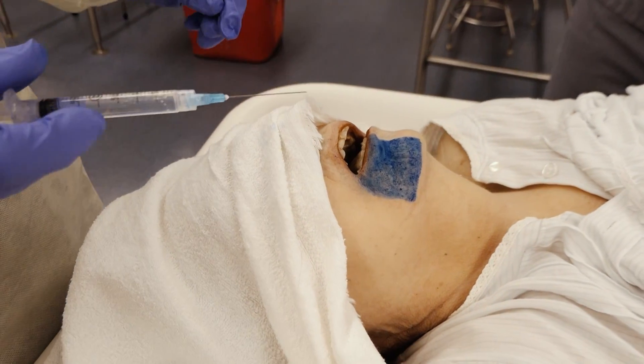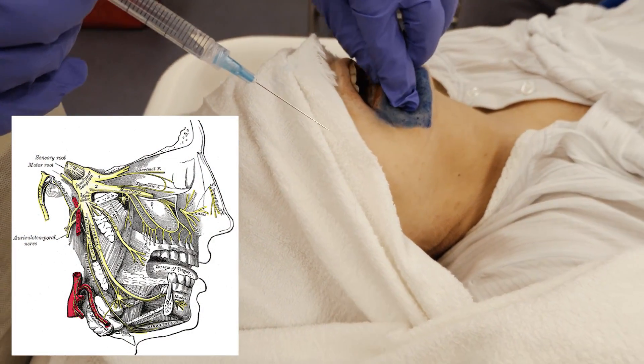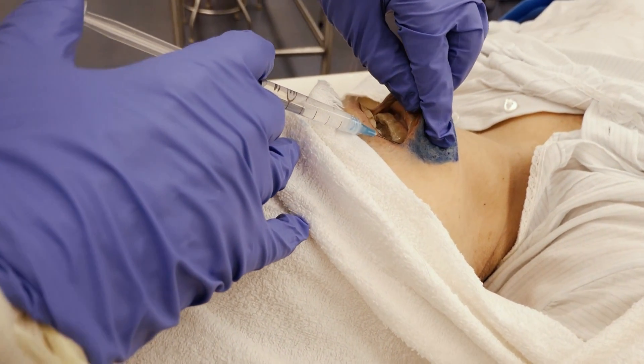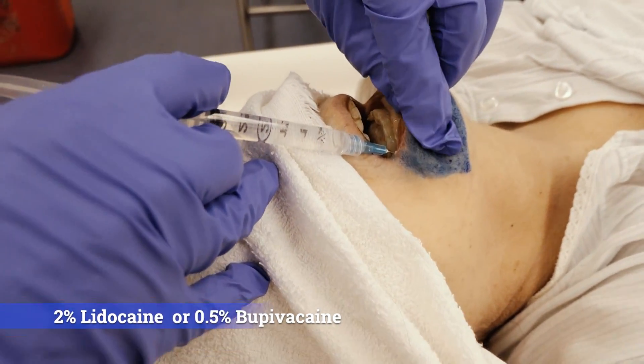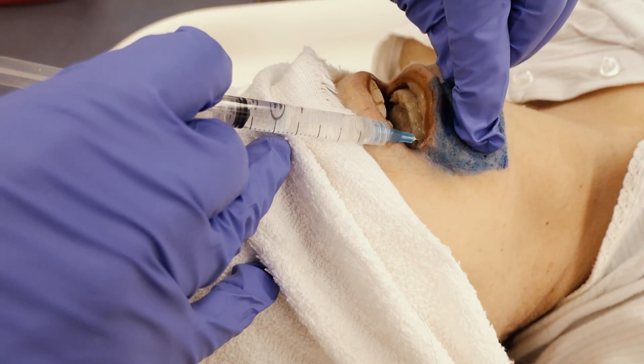After doing the topical anesthesia with the 20% benzocaine, you then inject again at the first premolar. You can actually feel the needle right at the foramen, and then you go ahead and inject.